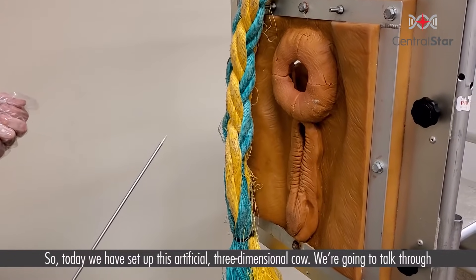Today we've got set up this artificial three-dimensional cow, and we're going to talk through the process from start to finish. We approach the animal with some lube that we present to the rectum. From there we present our palpation hand, which is naturally your left hand, and then we expose the AI rod. We insert upward at a 45-degree angle, and then as we start threading through the vaginal canal, we level that rod as we proceed forward. The AI gun will only go so far because we're going to hit the start of the cervix, and it's at that point that we'll begin using our palpation hand to proceed forward.